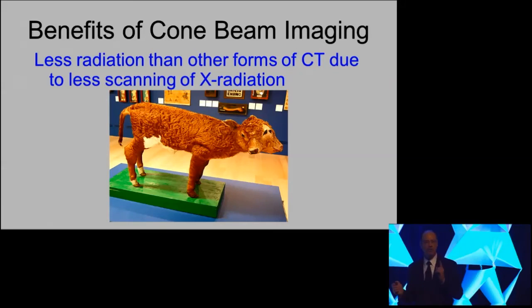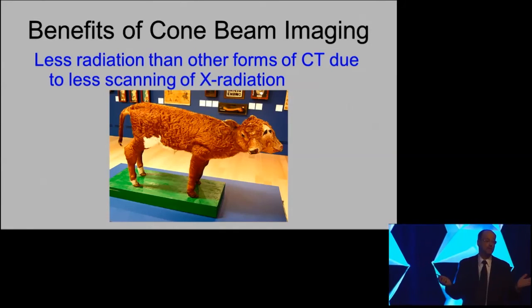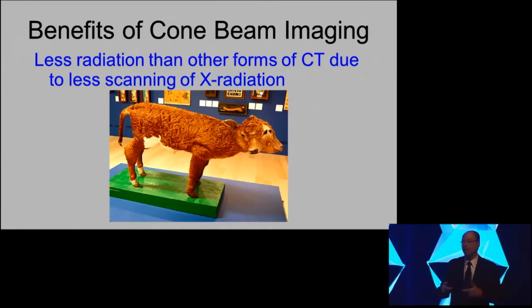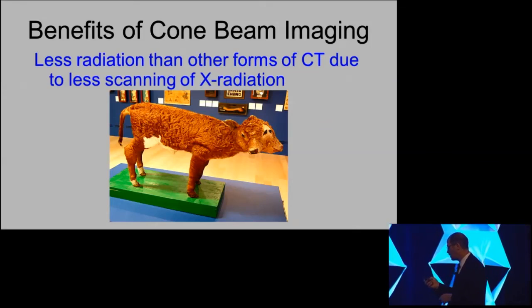And I'm sure some of you will remember that before cone beams were around, we actually did use data from MDCT units, the old, quote, medical units, because there was software that could evaluate the jaws and give you the type of reconstructions that we find very helpful in implant imaging. But it was very expensive, so it didn't keep up, and when cone beams came in, a lot of the software that had been used with the MDCT systems was incorporated into the cone beam systems.